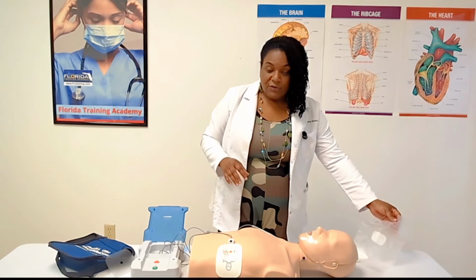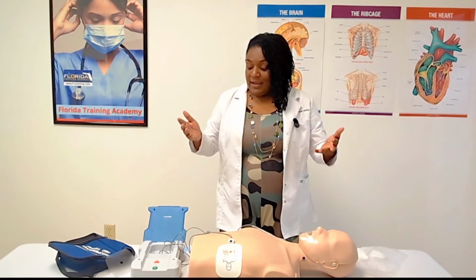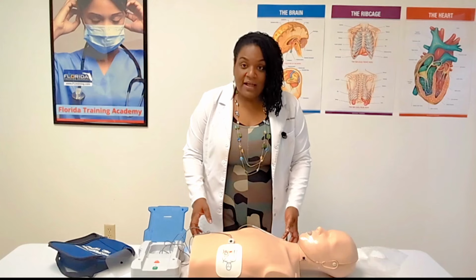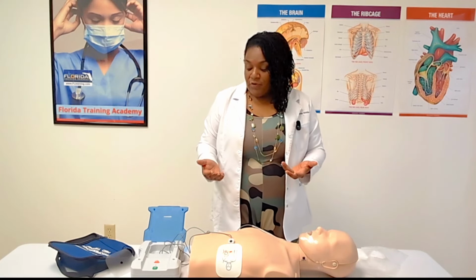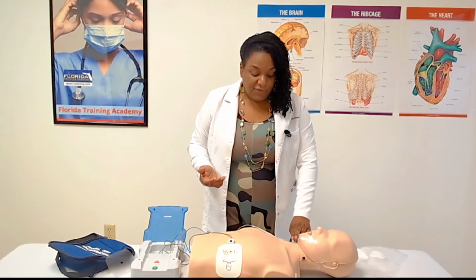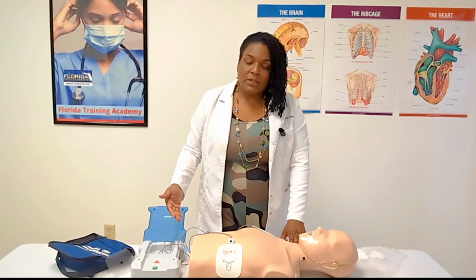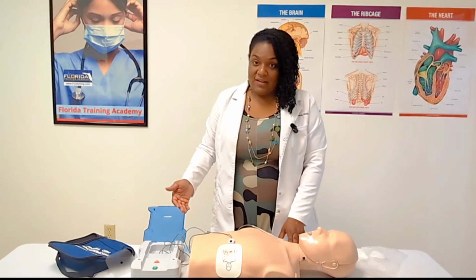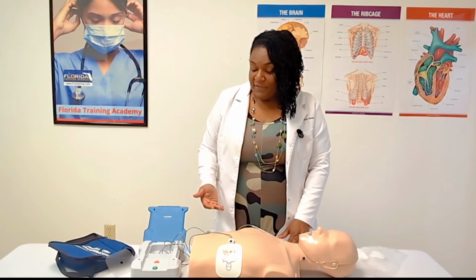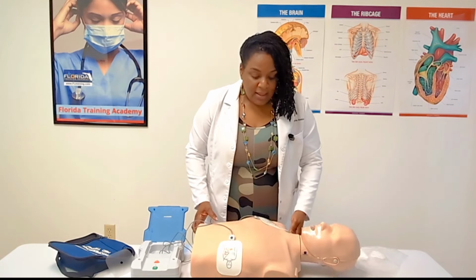You want to monitor for signs of life such as eyes flickering, finger movement. If the person is responding, or if they start having improvements such as improved coloration, you can go back and feel for a pulse, even though this is still beeping, because the AED is only going to reanalyze every 2 minutes, and we don't want to be doing chest compressions if the victim has signs of life. Once they have signs of life, you keep the device on.